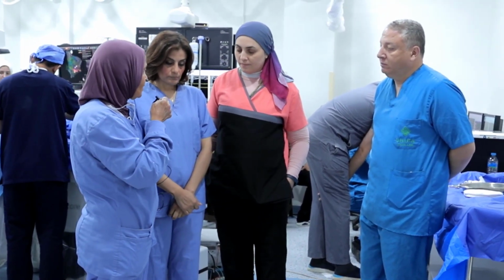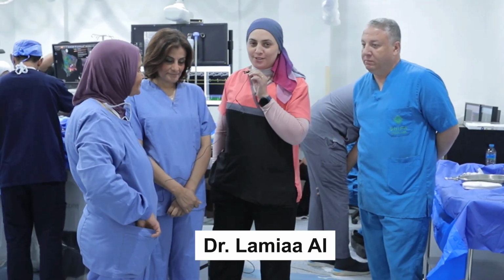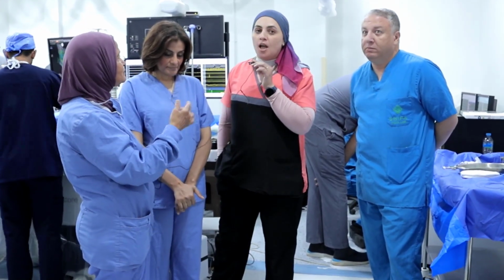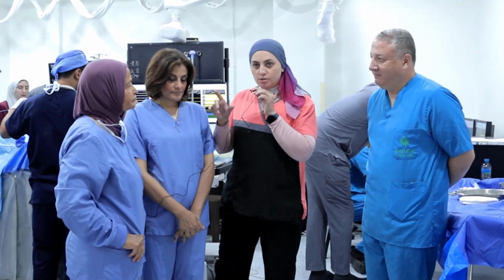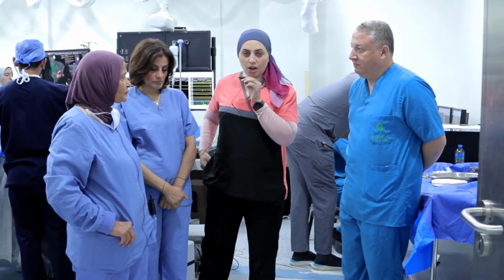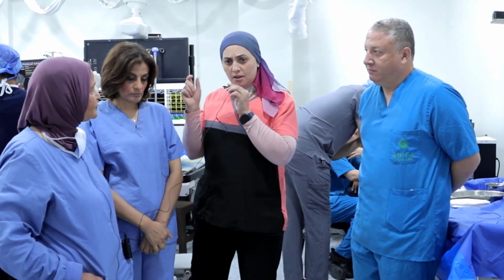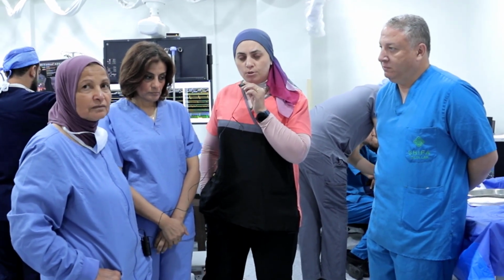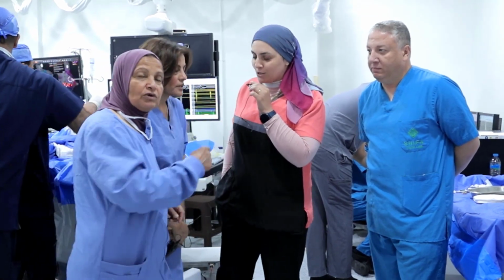So Lamiaa, are you convinced? I think so, yes, because after the ablation, for the first time we were not able to induce. We found a small gap at the level of the tricuspid annulus, and this gap was capturing during the induction and pacing. Once we ablated this gap and communicated with the previous line, we were not able to induce the atrial flutter again with different maneuvers. So I think it was a very successful procedure.